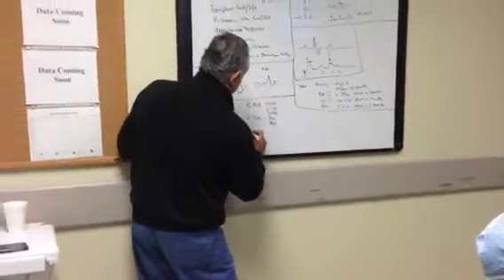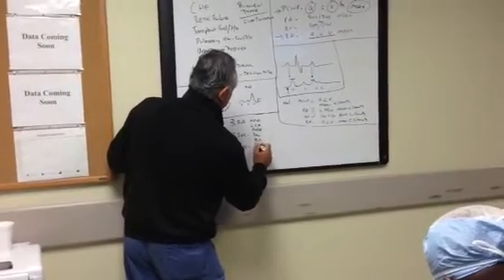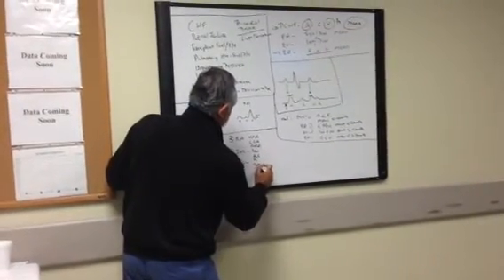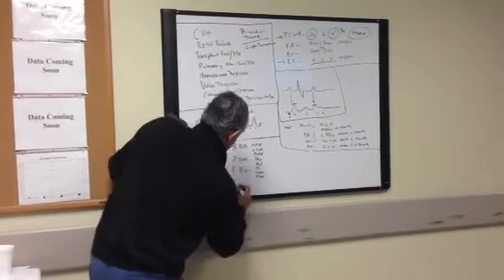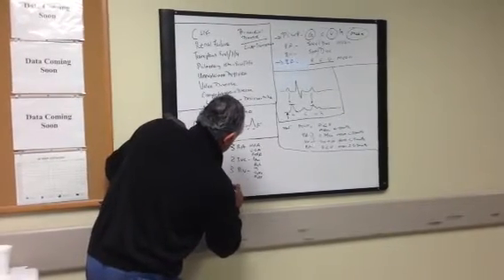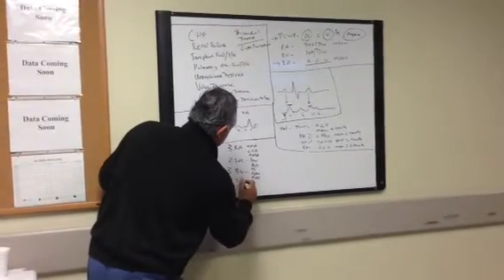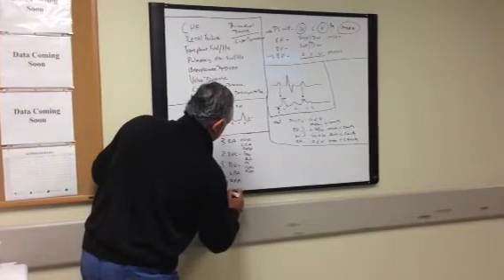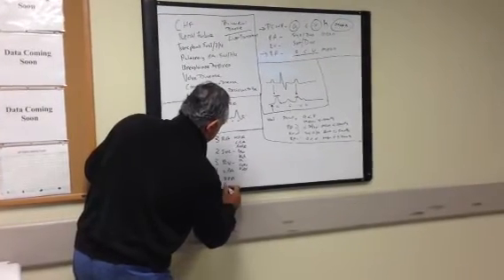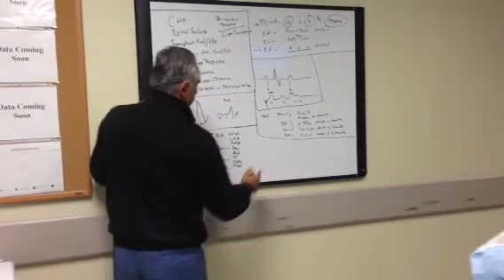In the RV, you want to again try to get 3. It's RV in, RV apex, and RV OT. When you're going to pulmonary artery, you want to try to get an LPA, so that'll be 1. You want to try to get an RPA, that's another 1, and then you want to get a main PA. So that's 3 in the pulmonary artery, all right?